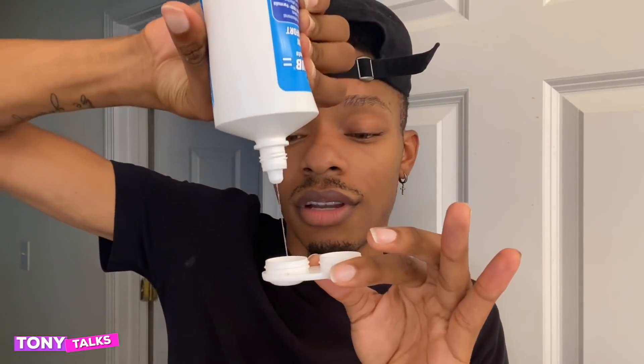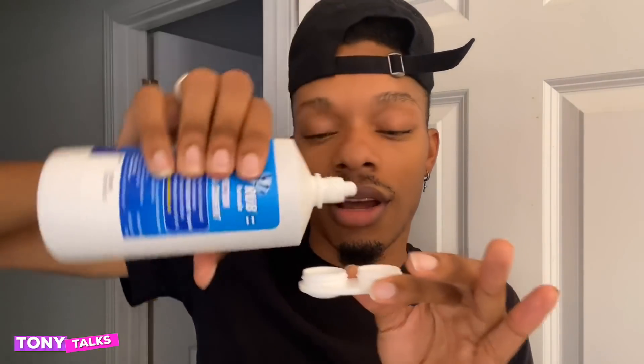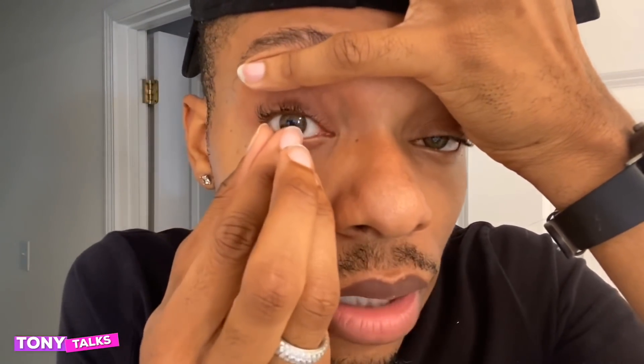All right, it's time to take these out. You ready? You take your solution, you pour it in the case — just like so, do it on the other one just like that. Make sure your hands are clean. The hardest part is putting them in; taking them out isn't really too bad. So you see how you can move it with your finger? When you get a hold of it with your finger, take it and slide it out.